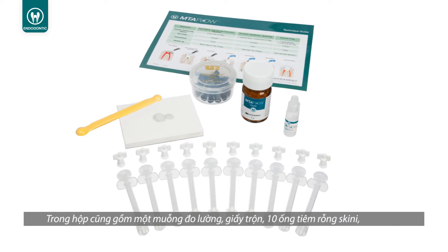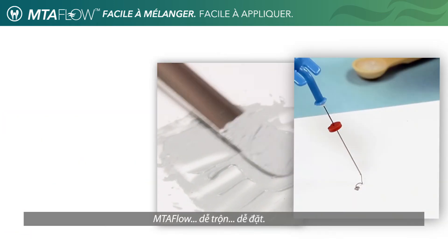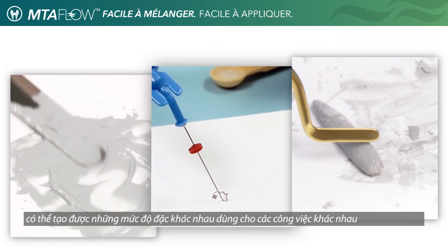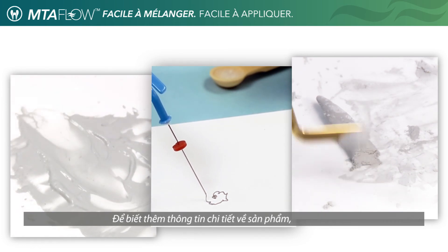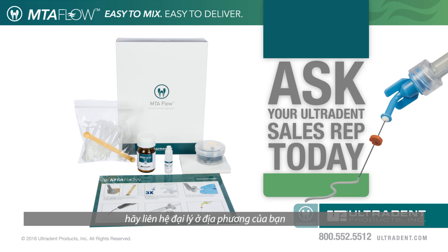The kit also includes a measuring spoon, mixing pad, 10 skinny syringes, 10 lure lock caps, and 20 black micro tips. Ultradent MTA Flow: easy to mix, easy to deliver, and the right consistency for the right procedure. For more information or for a product demonstration, contact your local representative.